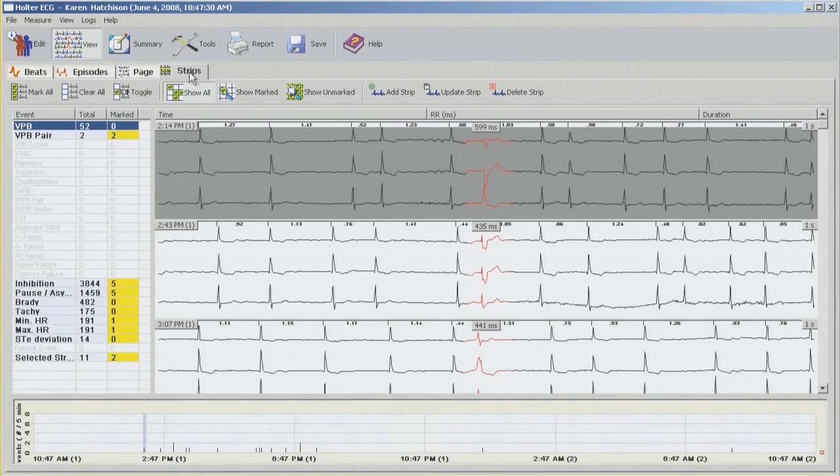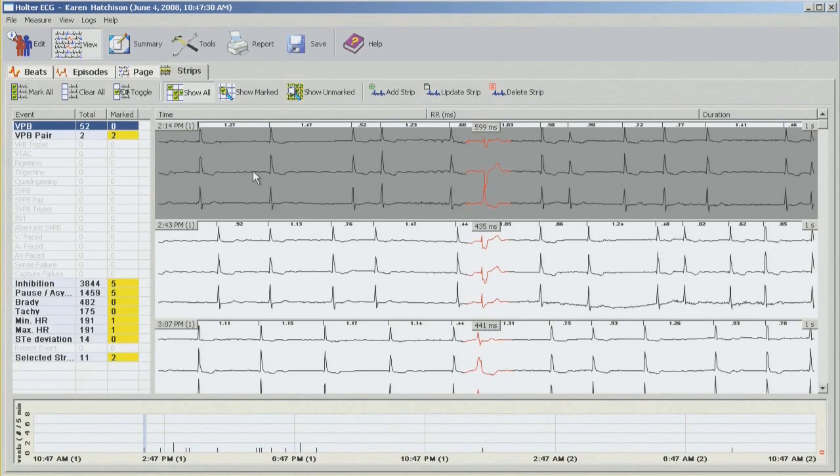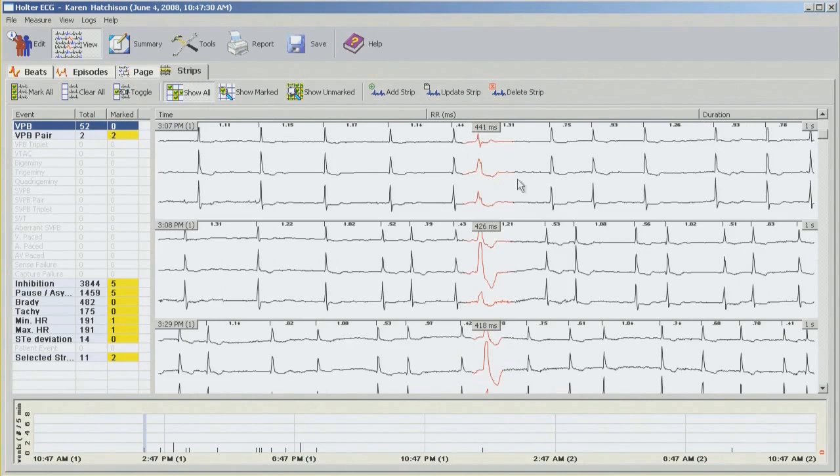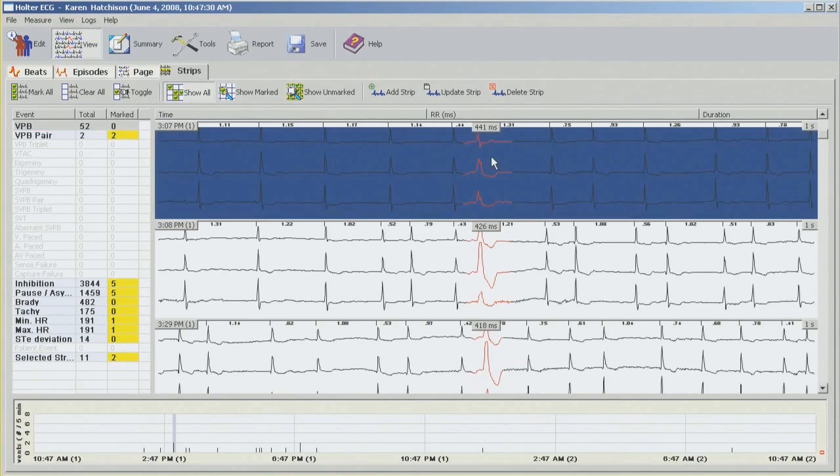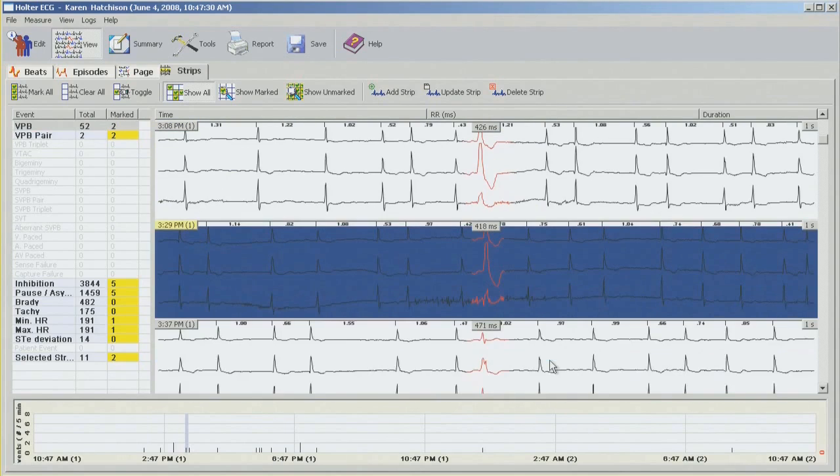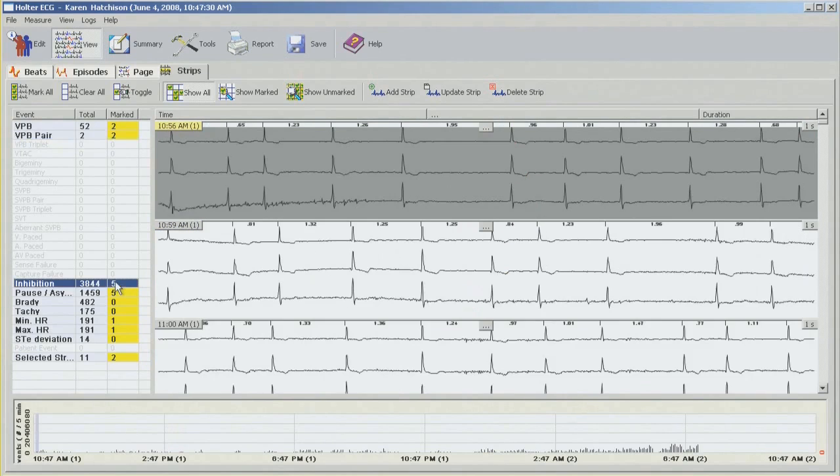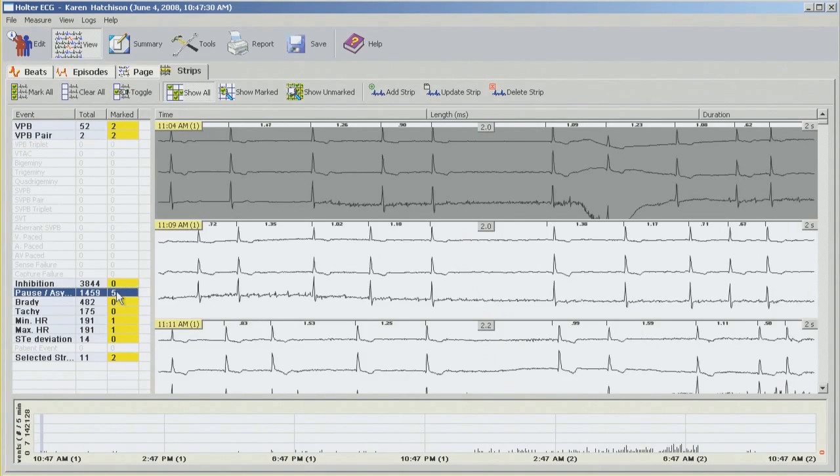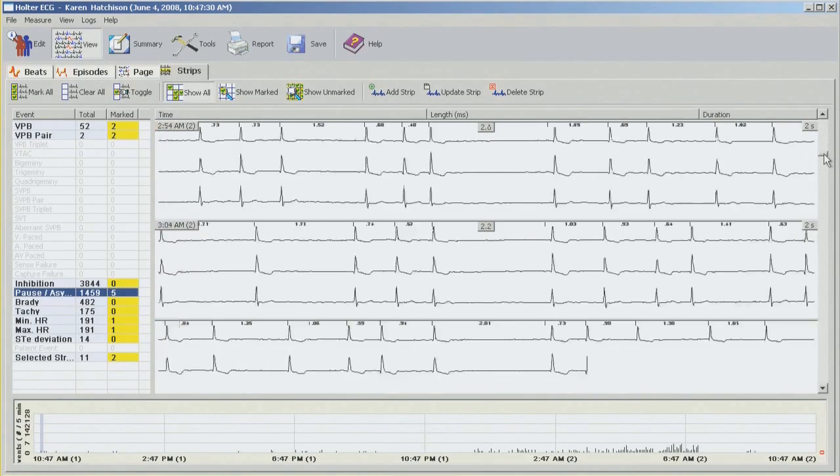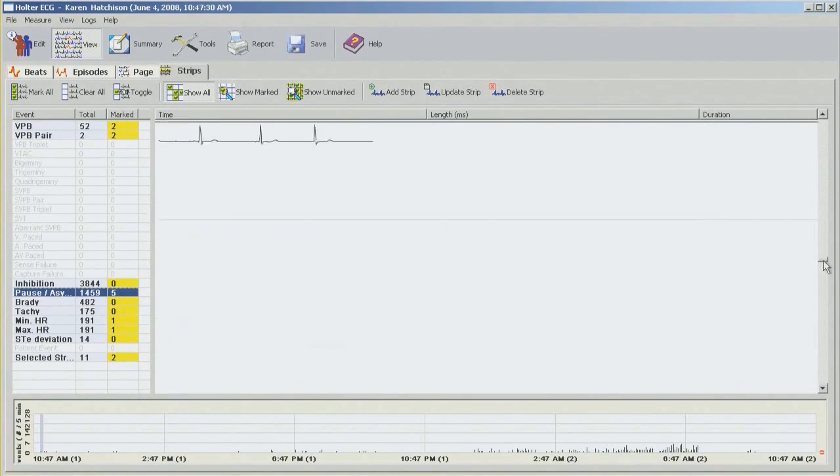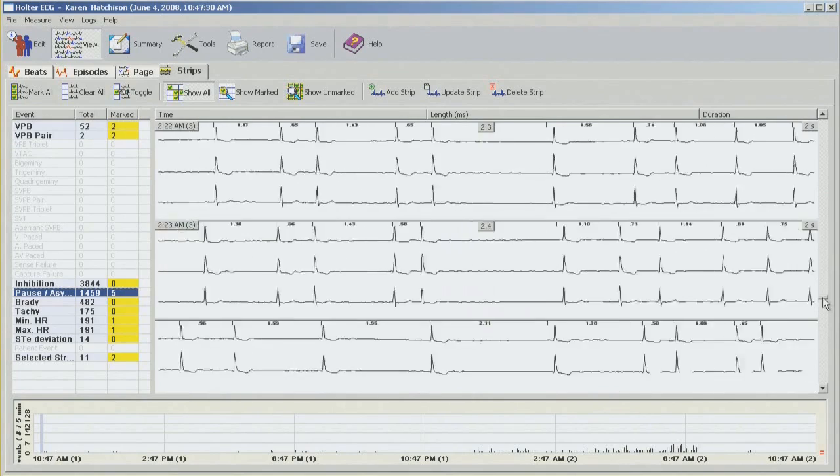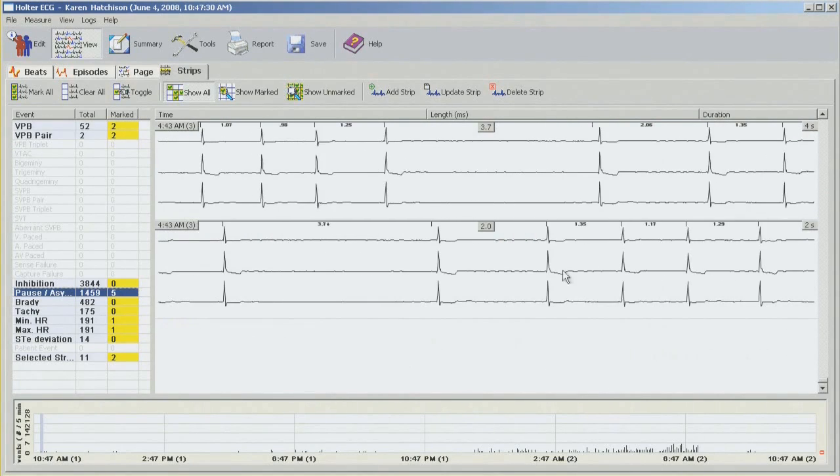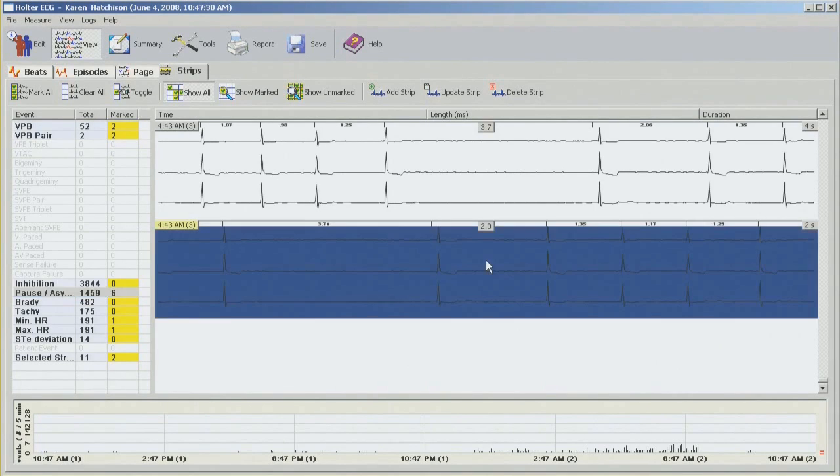And the last thing we're going to move into are the strips. So I want to select the strips which will show in my report. So starting with ventricular beats. None of these I have selected yet or none of these are marked. Out of 52 I would like to pick a couple. So all you need to do is just click on the strip and use the space bar on your keyboard to select one. So we have a couple of those. Now both couplets are already selected. You can see they're in yellow so we're happy with that.